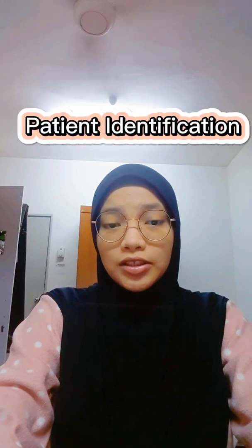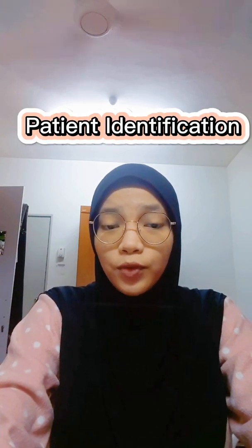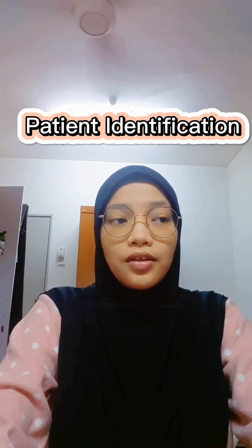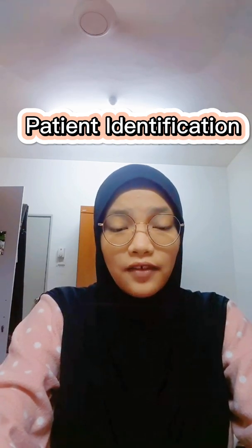Today I'll be doing the projection for PA ribs. So first of all, we have to do the patient identification. We have to call in the patient by his or her full name, check the date of birth, check the registered number, and check all the information that is stated in the folder.